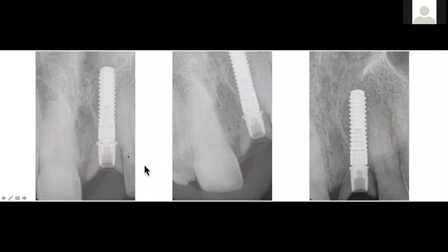I actually had Mike, after the initial insertion when we took this x-ray, reduce this even a little bit more because I thought that this was impinging a little too close on this bone. So you can see here, we reshaped this even more. Now, obviously, these tie bases were still wide. You can see these have been reduced.